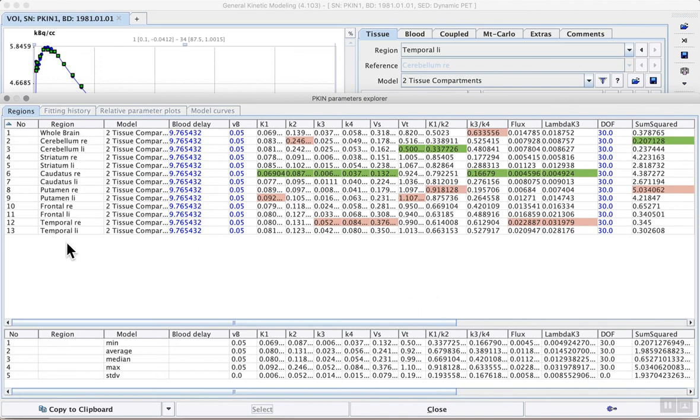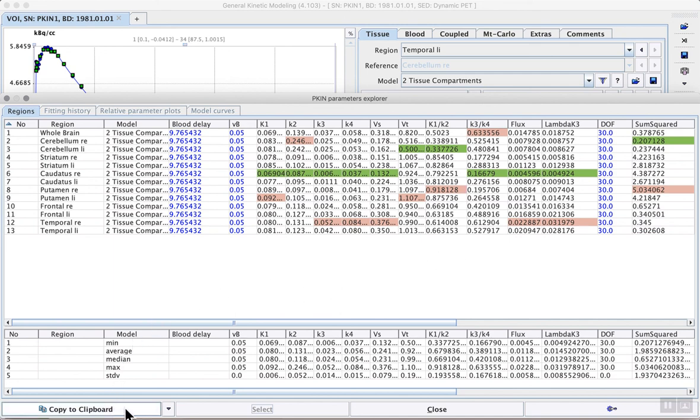In this case we see a table for all of the brain regions in which the model was fitted. We see the model that was used, the blood delay, and the available results. These results can be copied to clipboard for transferring to something like Microsoft Excel.